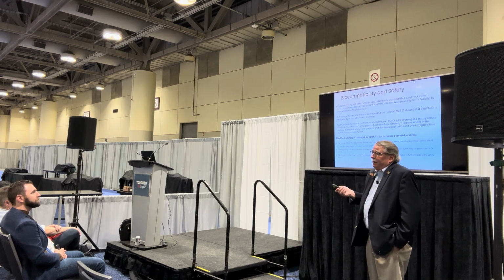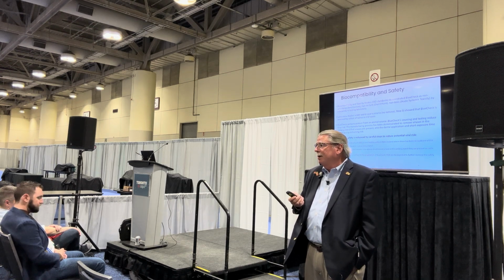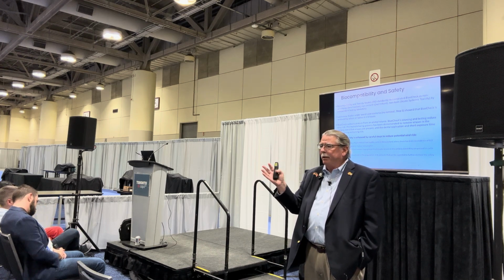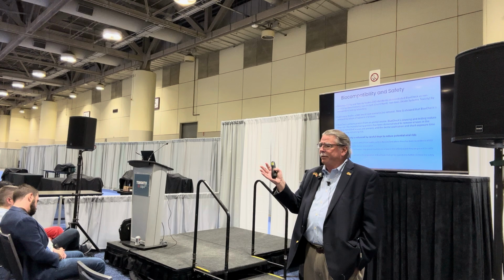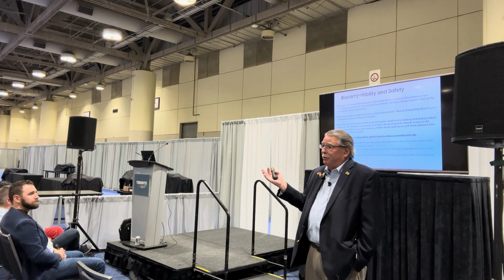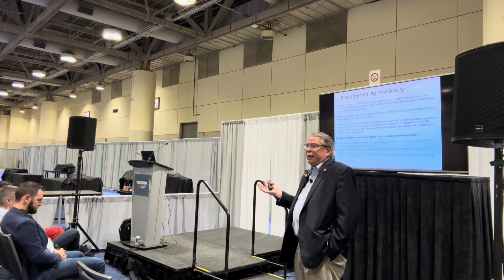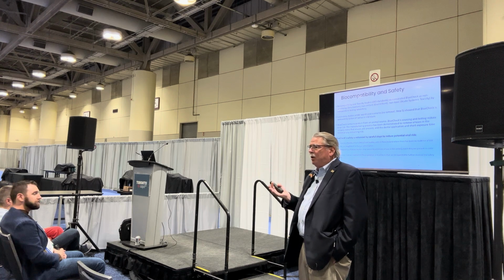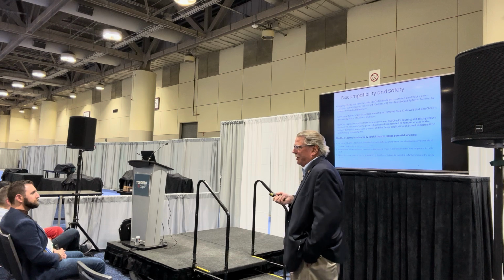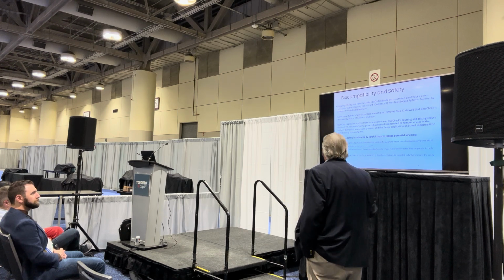So it's pretty clear. If you really are following these with pictures, you can tell from visit to visit if it's getting lighter or darker or staying the same. And I would hope, if it's not carious or if it's improving, you treat accordingly. If it stays the same, you might want to put a sealant on it or something like that. But the whole idea is you see stuff early. Obviously you take the blue off before you put your sealant on or whatever. But you can really intercept early, and I think that's healthy.